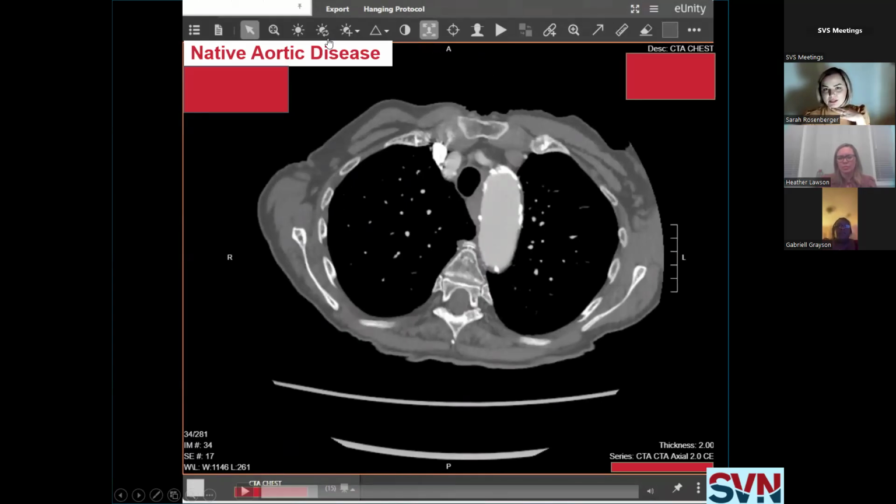So for those of you who don't look at CAT scans all the time, I preset this to the CTA window, so you can have different amounts of exposure or penetration, kind of thinking about it like if you were a photographer and you put different exposures on, you know, you put it in the dark room for different exposures, you could get different penetration of the pictures.